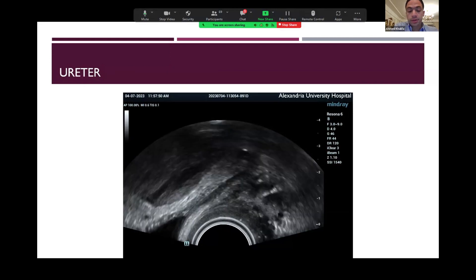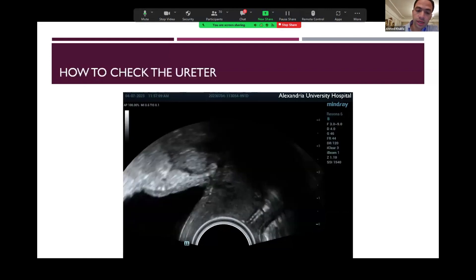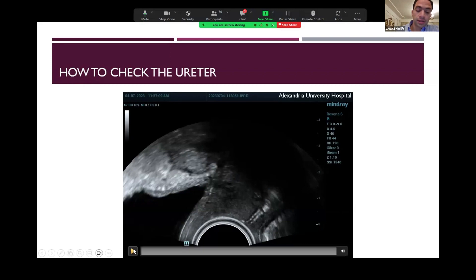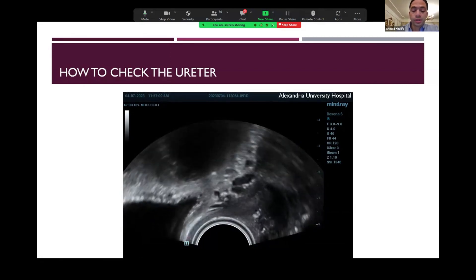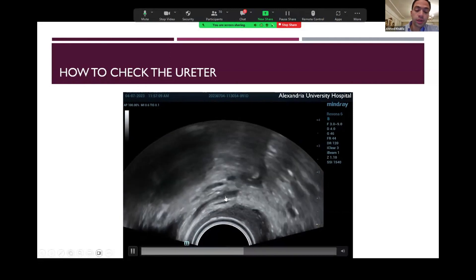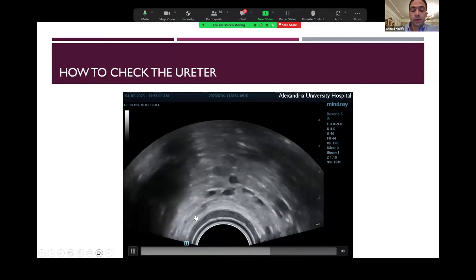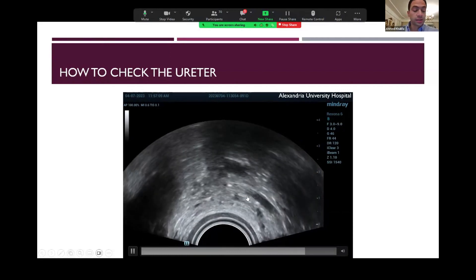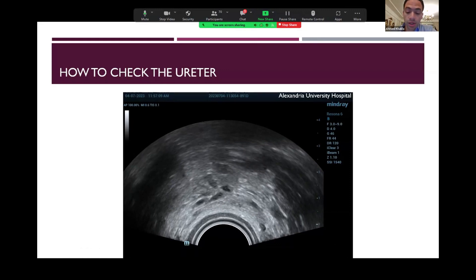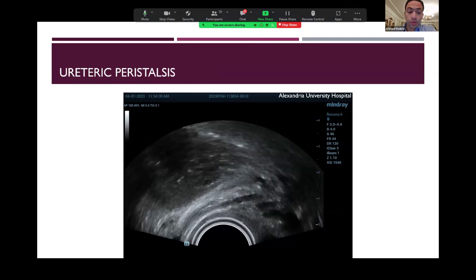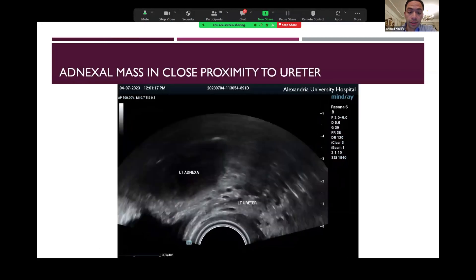We will switch to the ureters. The ureter appears as a tubular hypoechoic structure passing into the trigone of the bladder on both sides. Technically, you need to withdraw the probe slightly outwards into the vagina, then sweep gently to the right and left with a slight twisting of the transvaginal probe until you can straighten the ureter. You will keep following the ureter until reaching the great vessel on the lateral pelvic wall and the uterine artery from its origin — this is the lateral parametrium, also an important site to check and exclude any presence of deep endometriosis.